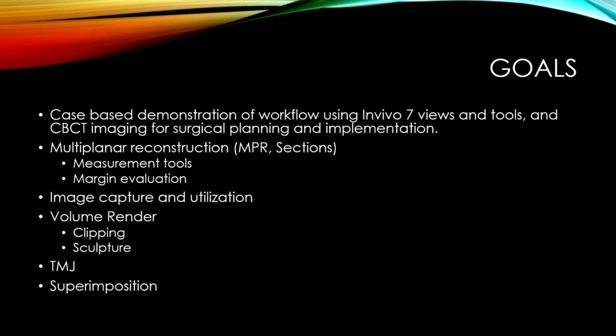We're going to talk about multiplanar reconstruction, MPR, which in vivo calls sections. You can actually go in the preferences and change the name of the tabs if that makes it easier. You can even get rid of the tabs that you don't use, because there's lots of other human stuff on there that's not super relevant to us veterinarians. And we'll use that to measure things and help us better evaluate margins.